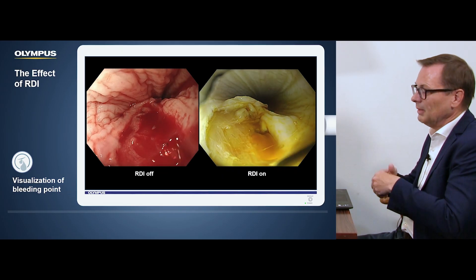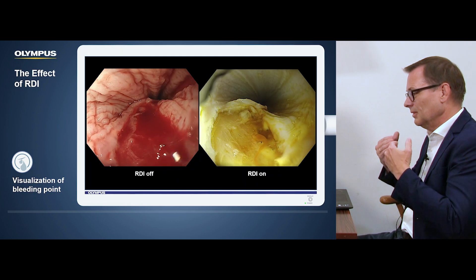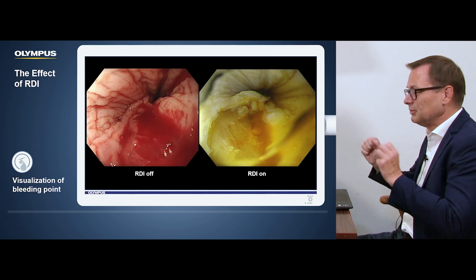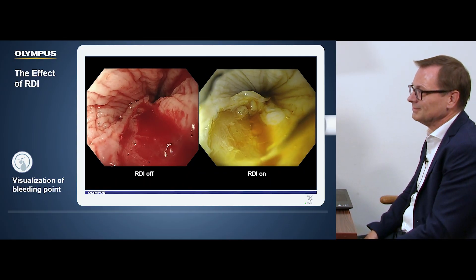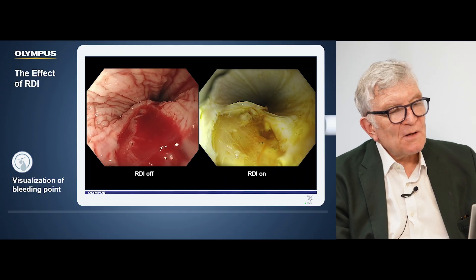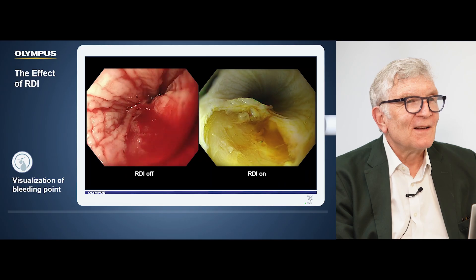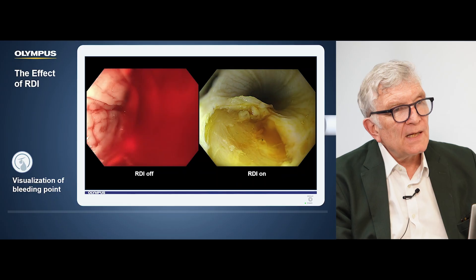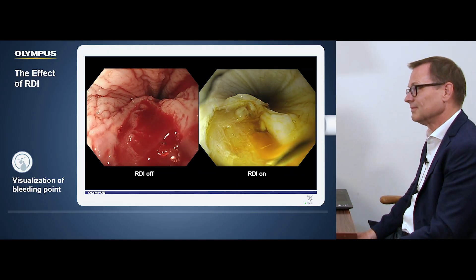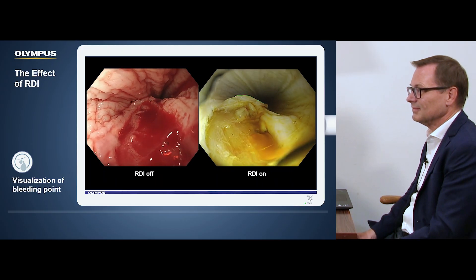On the left side you see the white light, on the right side RDI, and it even looks like you are looking through the diluted blood and you can see the bleeding spot very nicely. People also say in discussions it's more reassuring if bleeding is orange because it doesn't look that dangerous. But we can summarize that there are two purposes: one is to identify a bleeding spot better — though it doesn't work in massive bleeding where everything is red — but in bleeding of moderate intensity, I think it can be helpful.